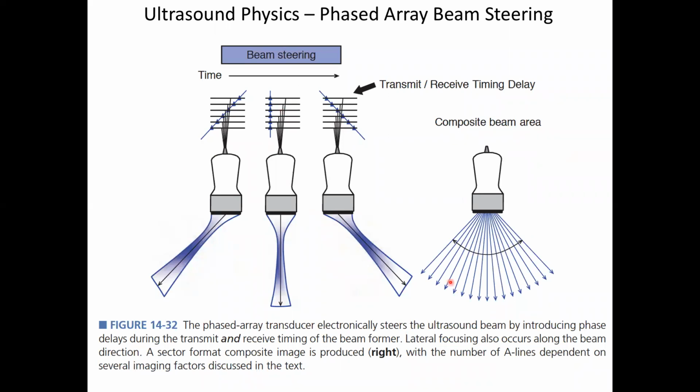So this slide just reviews, I think we've talked about this enough, basically the phasing of the oscillation of these individual elements and sectors on the transducer can change your focal position and depth, right? And so we change our focal position over here, we basically have a beam that's going sideways, right? And then we change the focal position to here and here, and we can sweep back and forth just by doing phase shifts on the individual elements.